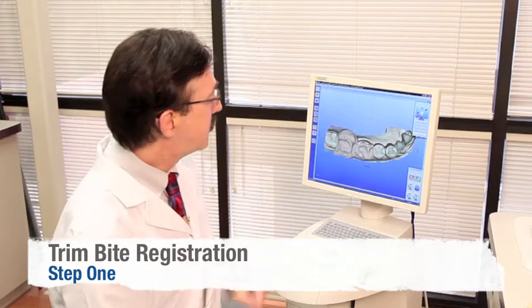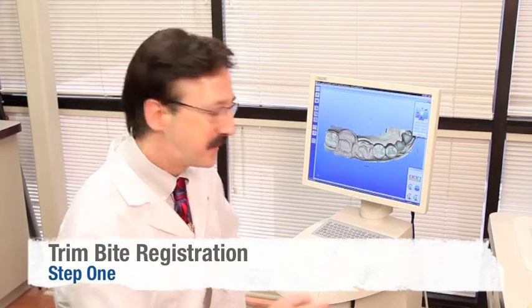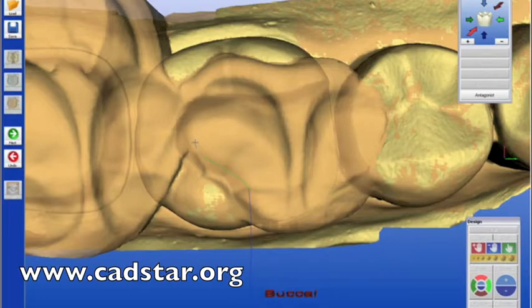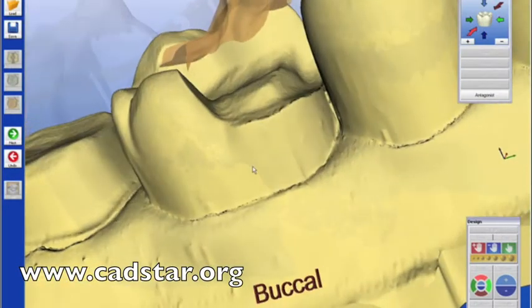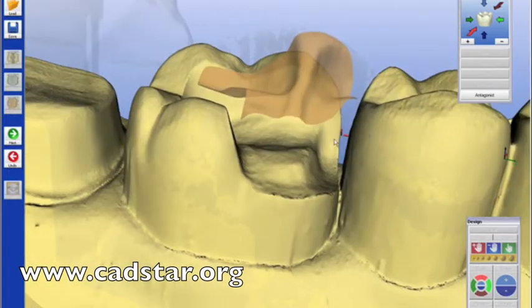Step number one is to trim our bite registration — it kind of sounds like a laboratory procedure. We'll take our crosshair and double-click the mouse, staying about a millimeter away from the occlusal surface margins, clear over to the adjacent interproximal contact surface of the second premolar, and around. Once you cross over your initial start position, you'll have your bite registration and you can see the index of the upper maxillary tooth as it will fit into the restoration.